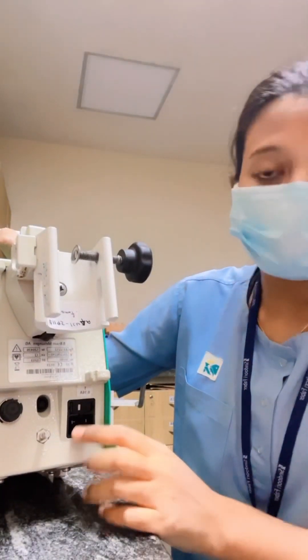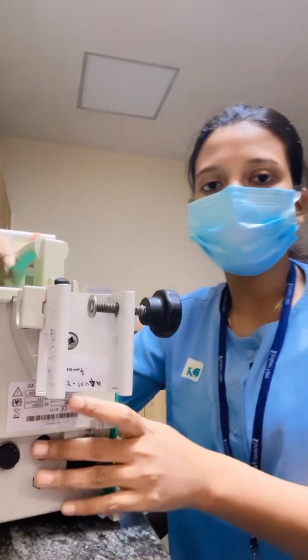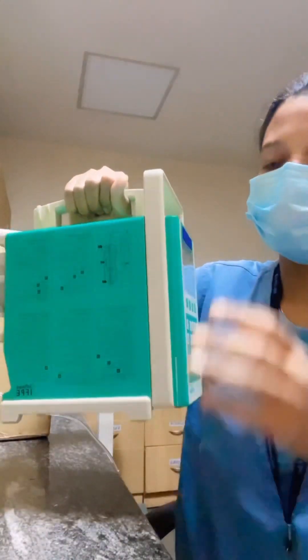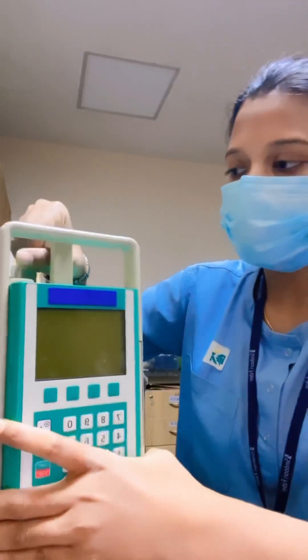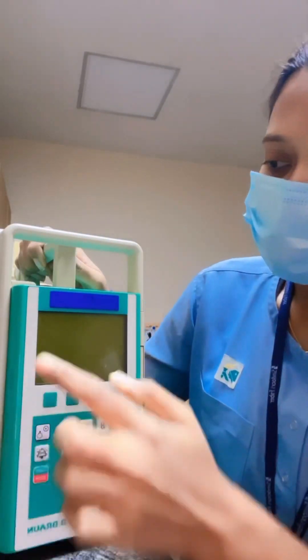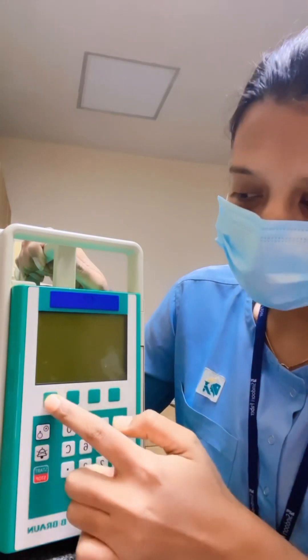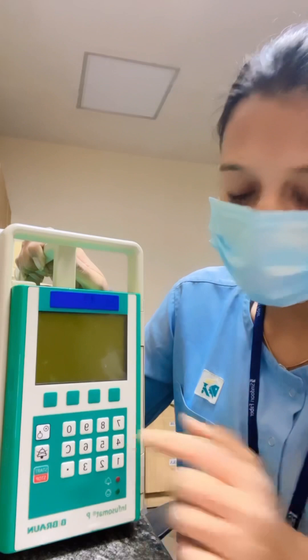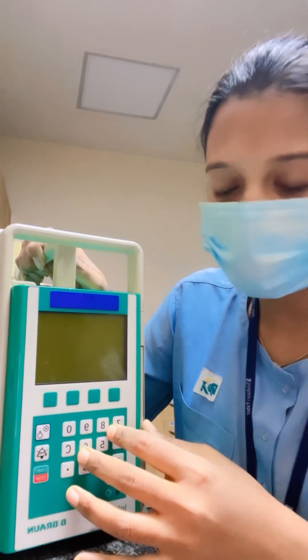This is the power socket — always use the machine on power. Always hold the machine like this, not like this, as it can damage the machine. This is the handle. This is the display, these are the soft keys, and these are the keypad for setting the rate or any other settings.